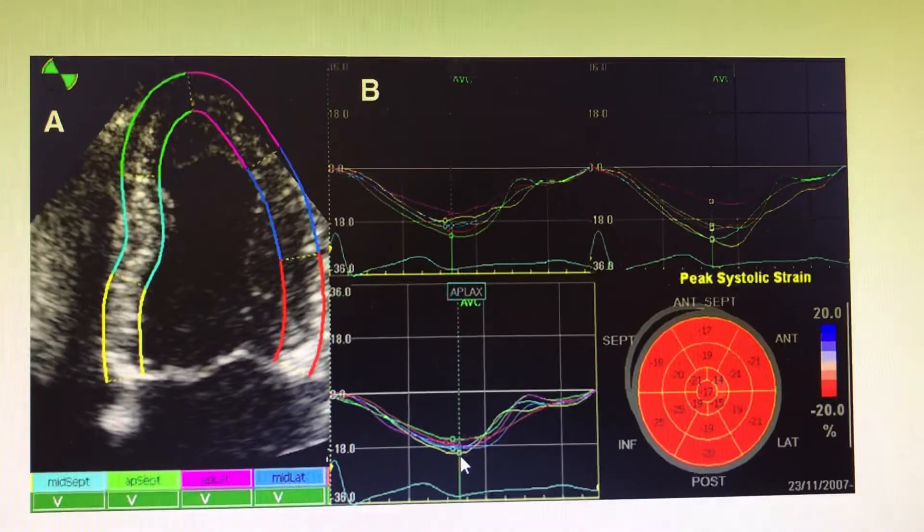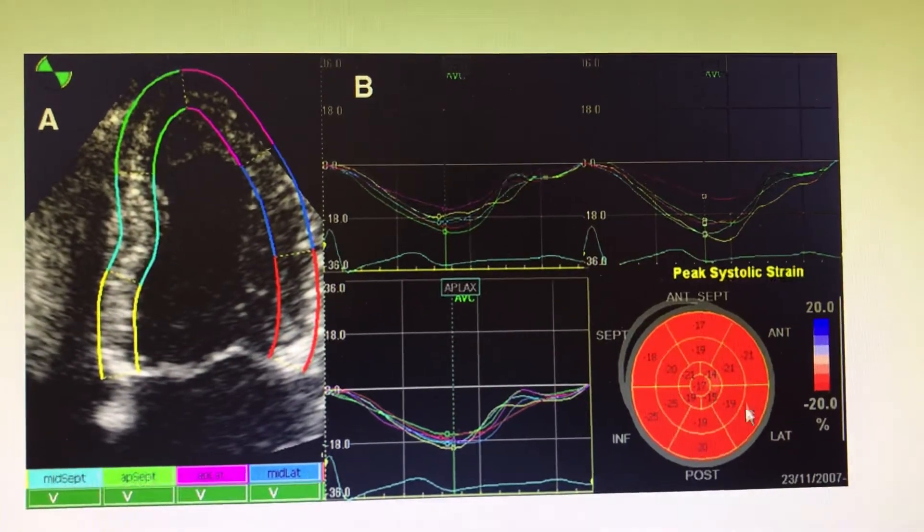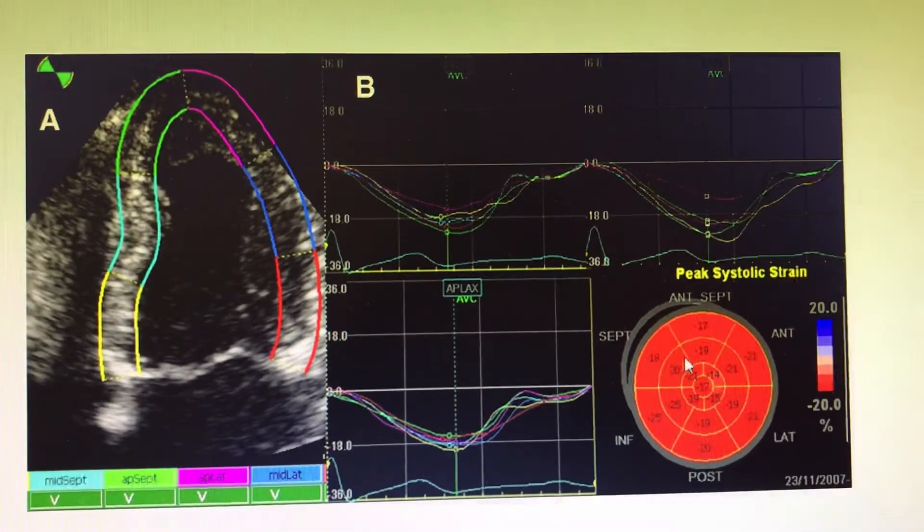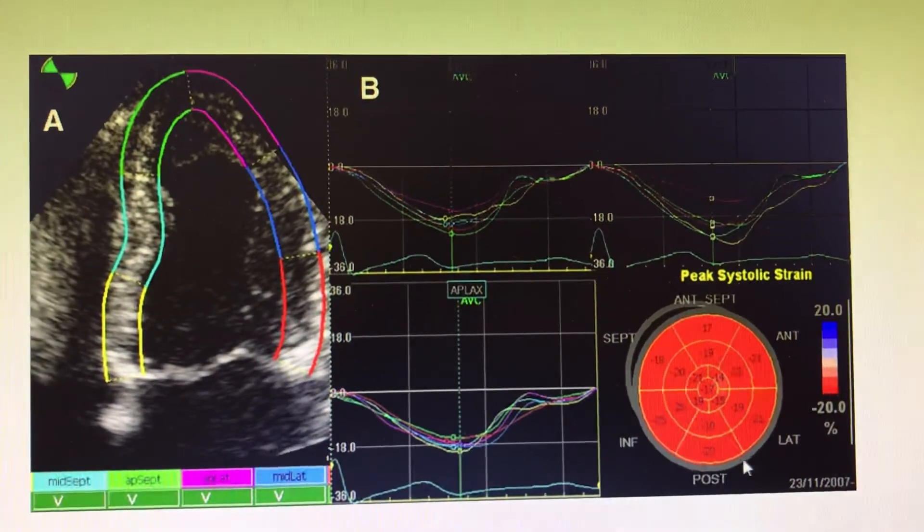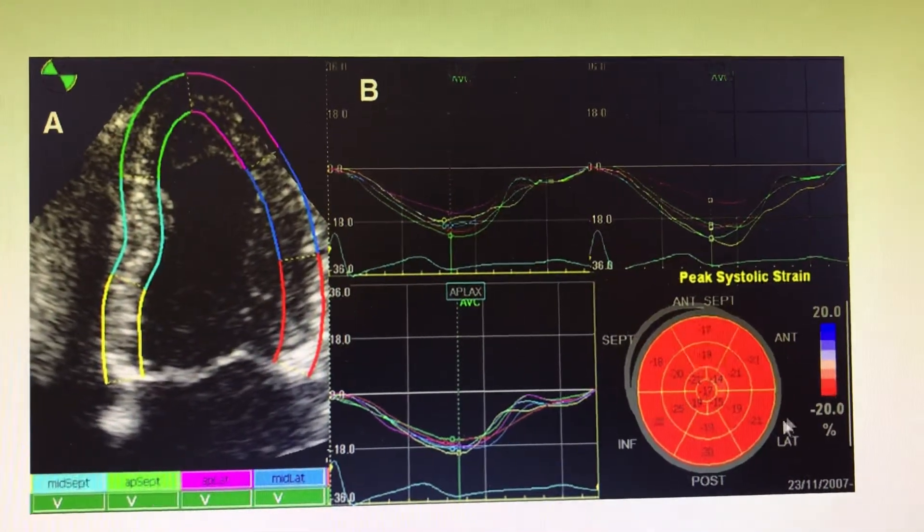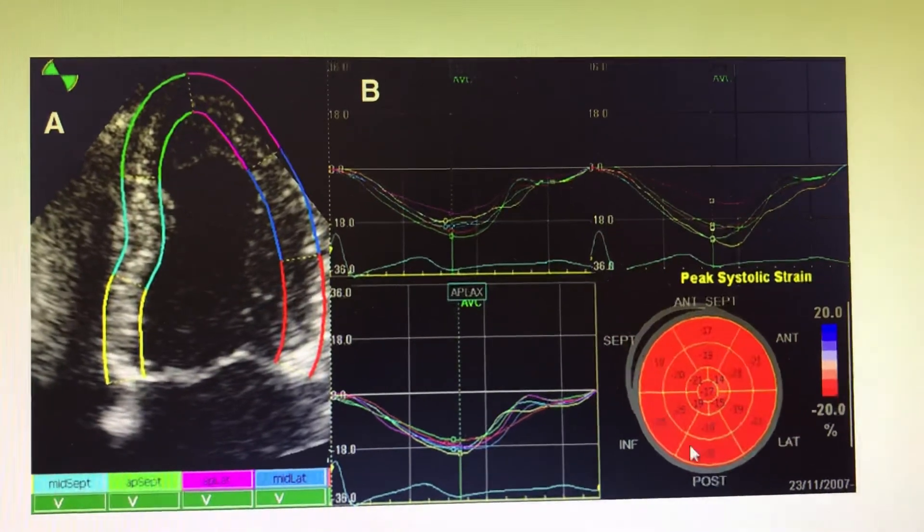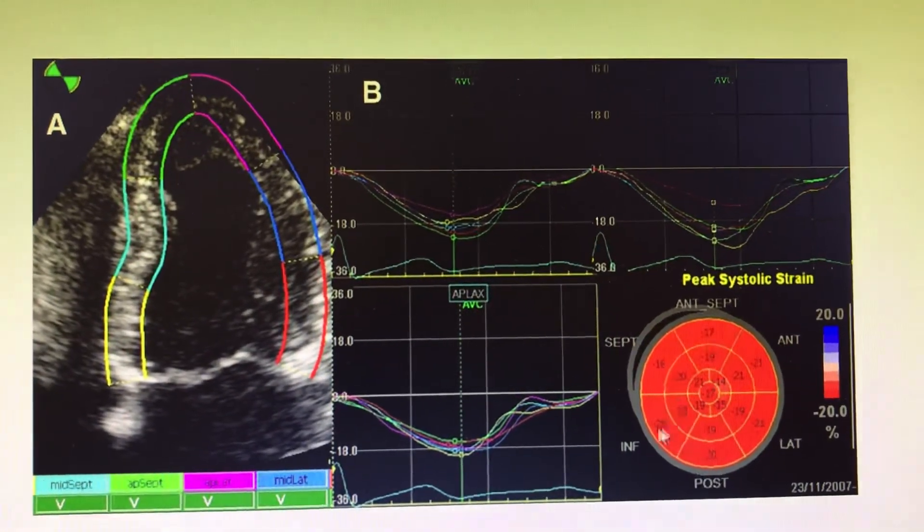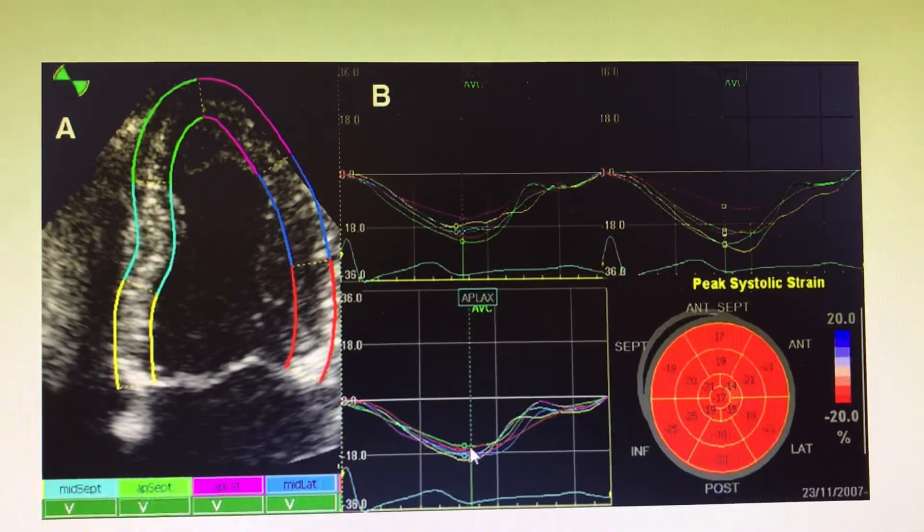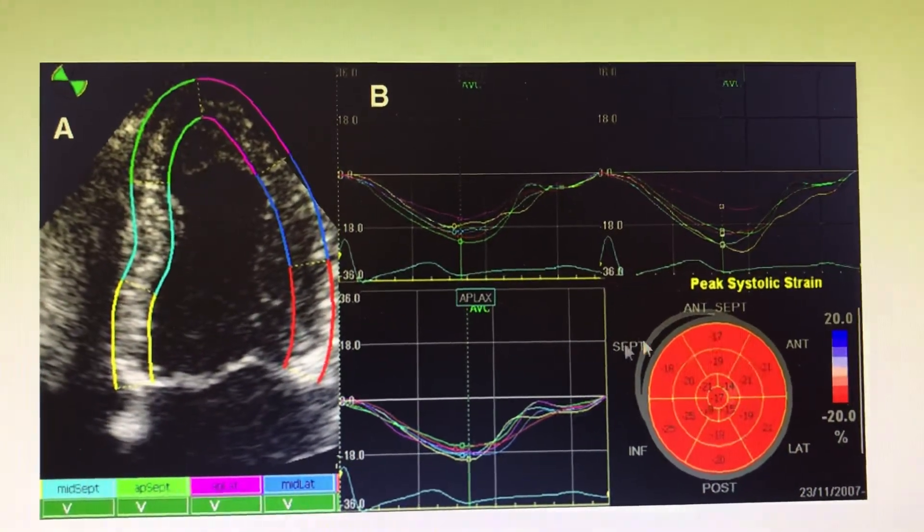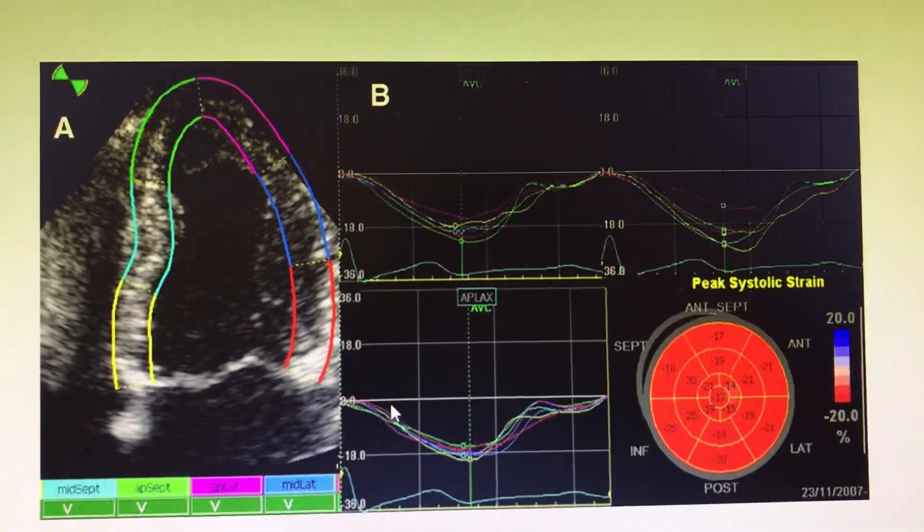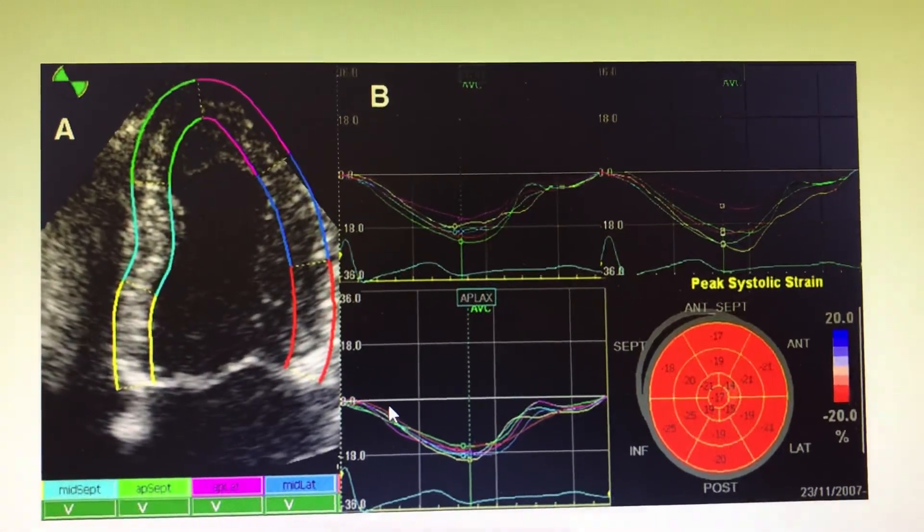The basal walls have the highest negativity. The anterior septal has less at around minus 17, and the apex even less. The lateral and inferior basal walls contract the most, showing values like minus 25 and minus 21. More negativity indicates more contraction. This is how contraction across the speckle is visualized in the software.